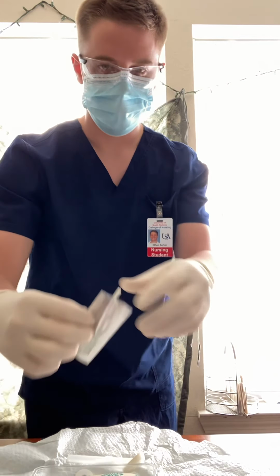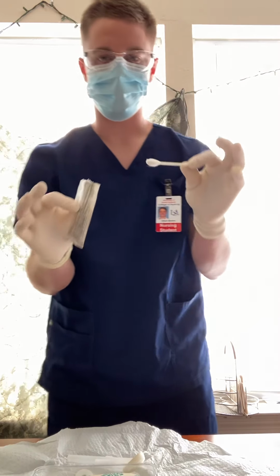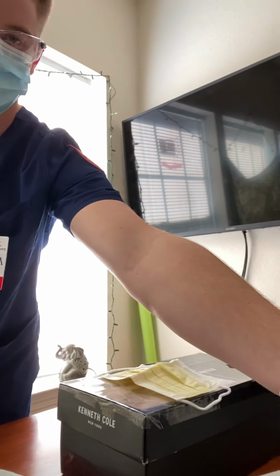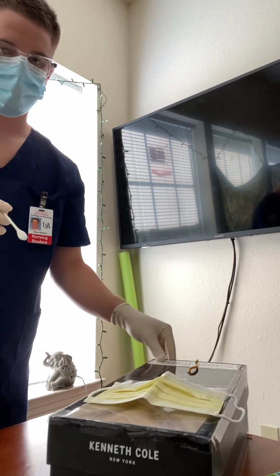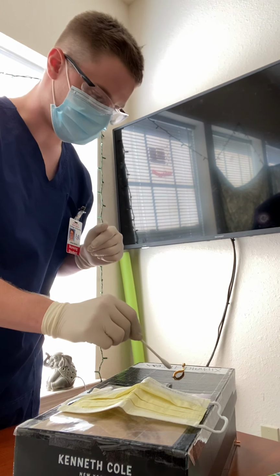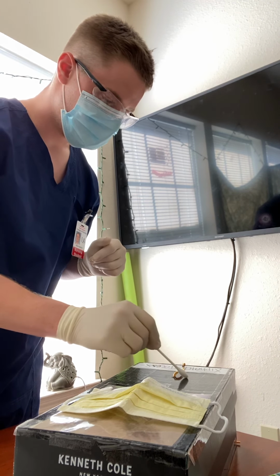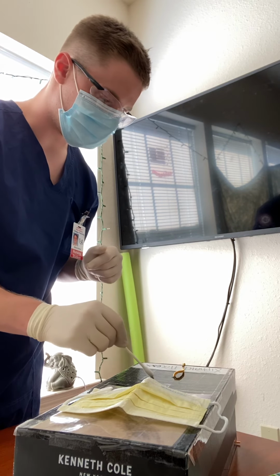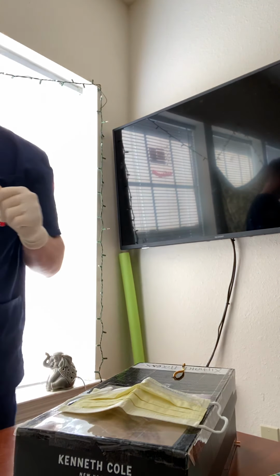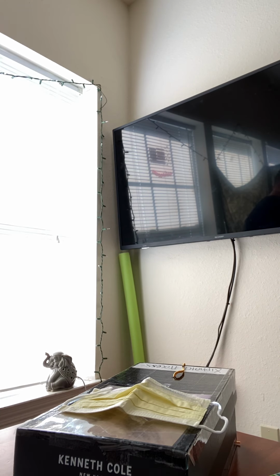cleanse the site with an alcohol swab. So I have my alcohol swab right here. I'm going to dispose above waist level. Then I'm going to break sterility, turn the camera so you can see me cleaning the site. Okay, so now that I have that set up for the camera to see, I'm going to clean around the injection site, circular motions, getting farther and farther away from the injection site. Then after I've done that, I'm going to dispose in the trash can above waist level.